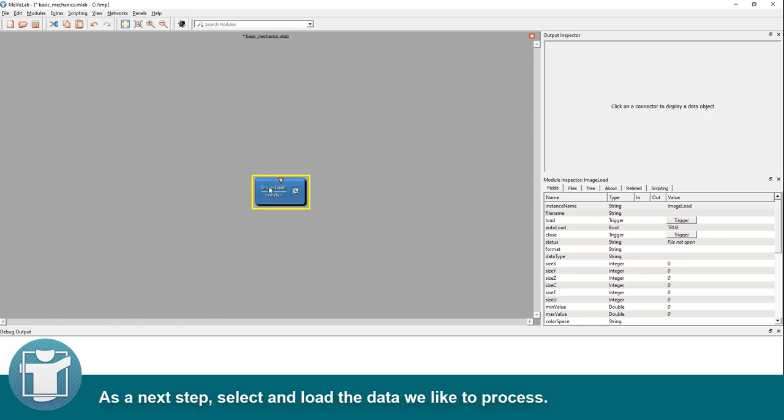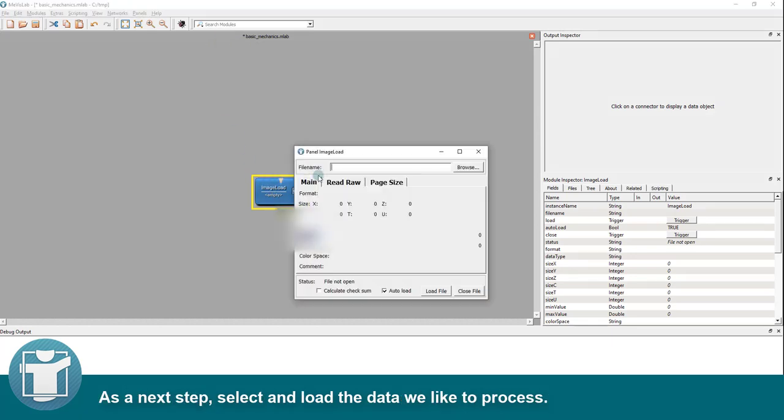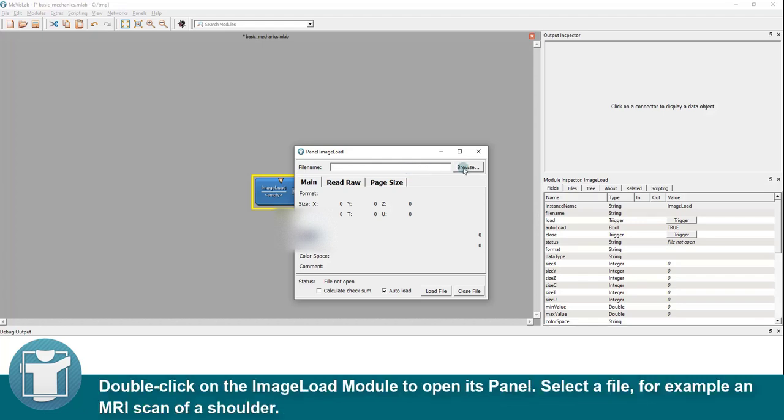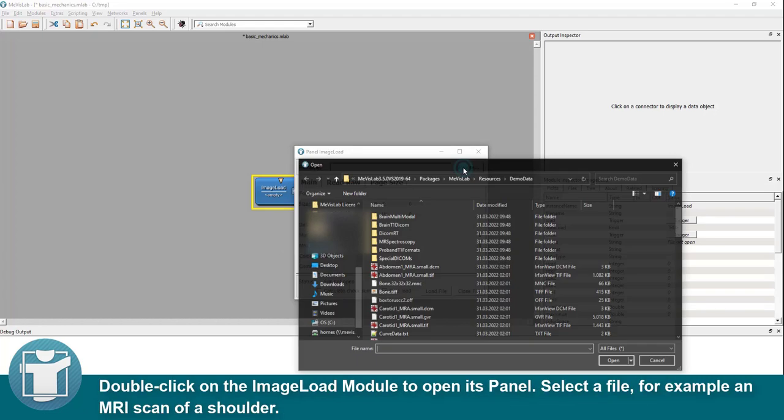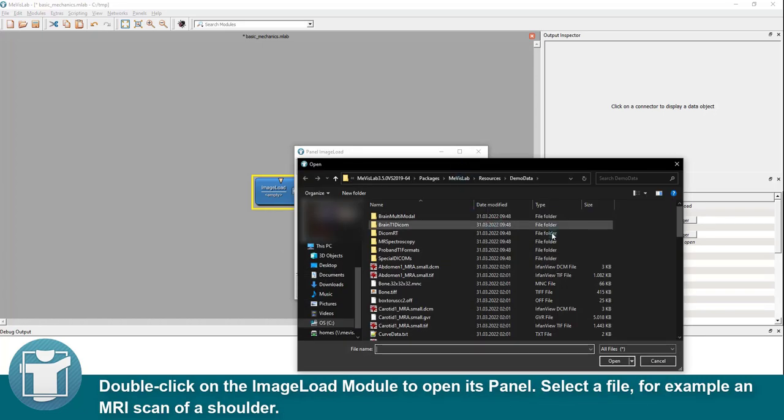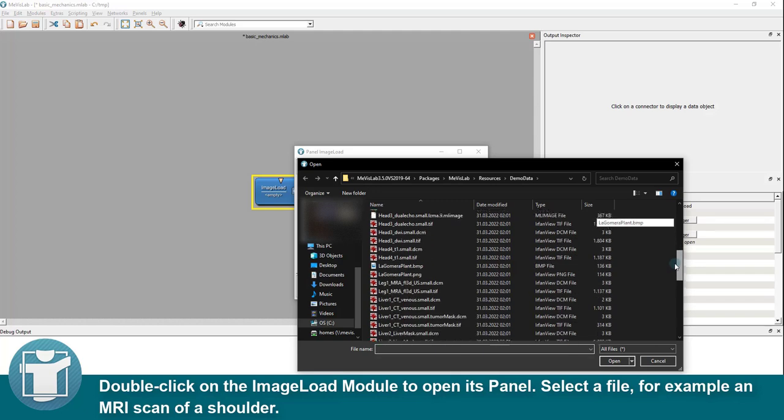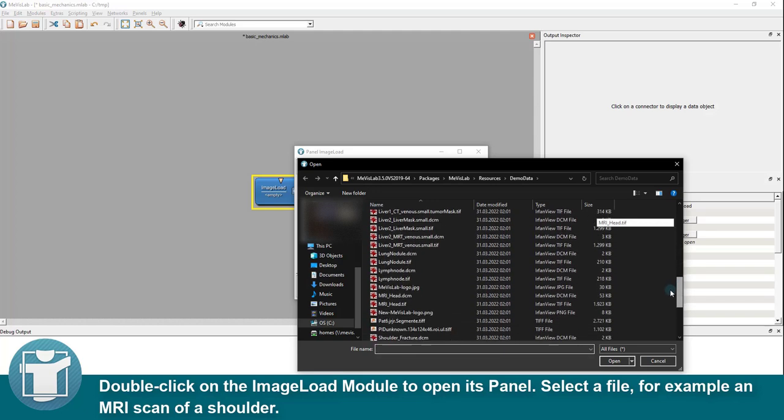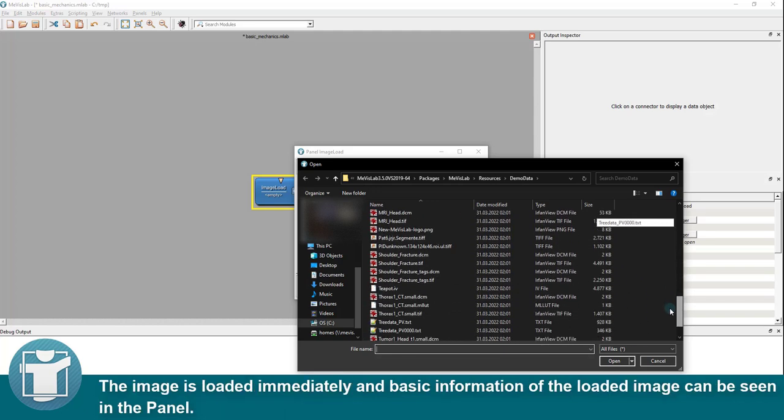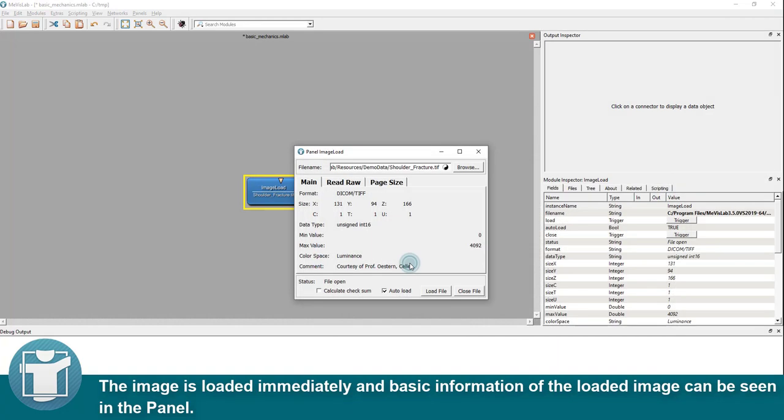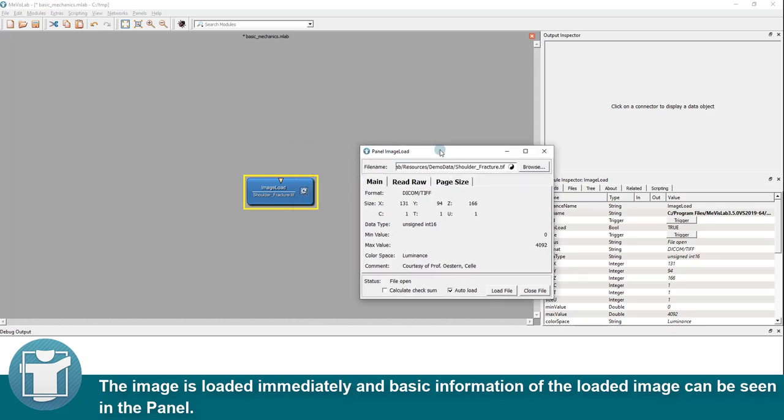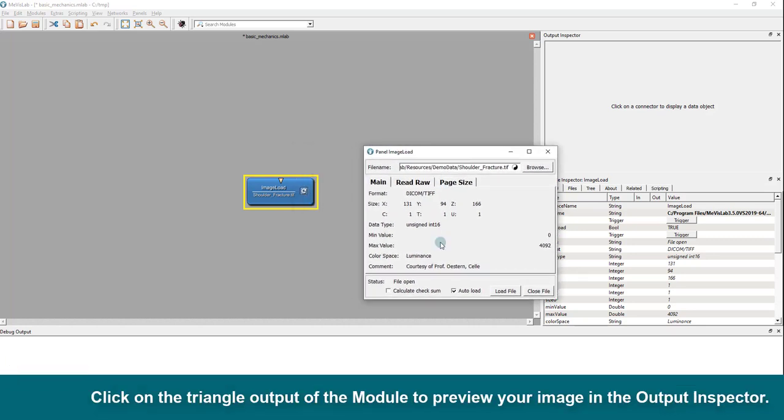As a next step, select and load the data you like to process. Double-click on the image load module to open its panel. Select a file, for example an MRI scan of a shoulder. The image is loaded immediately and basic information of the loaded image can be seen in the panel.